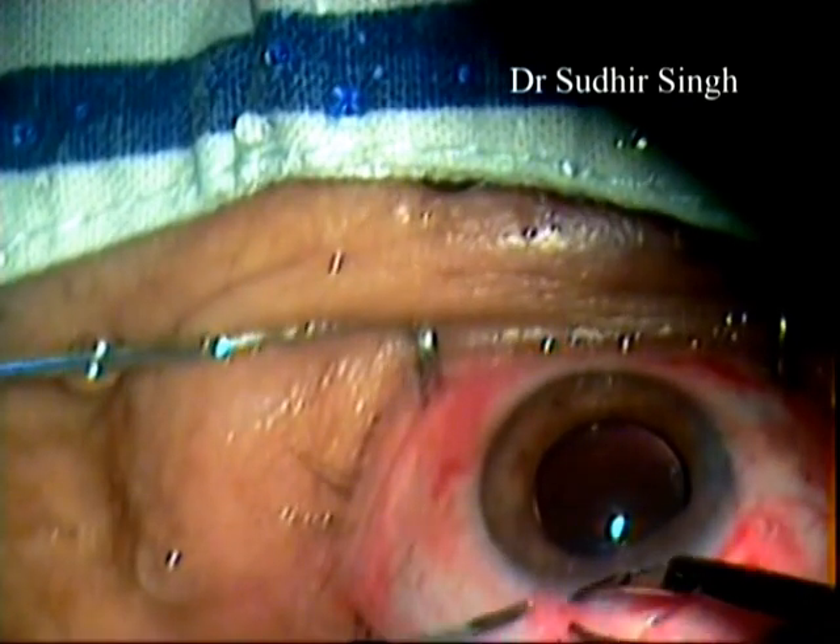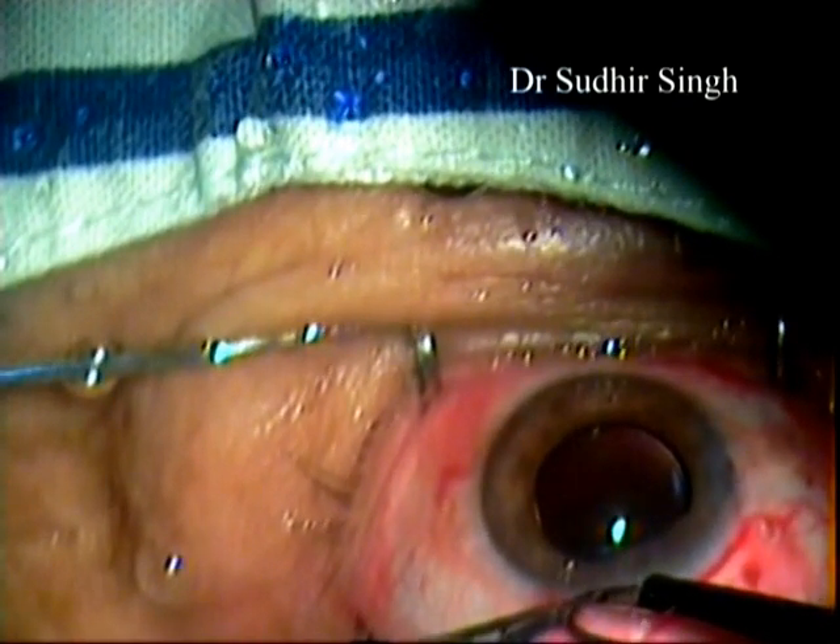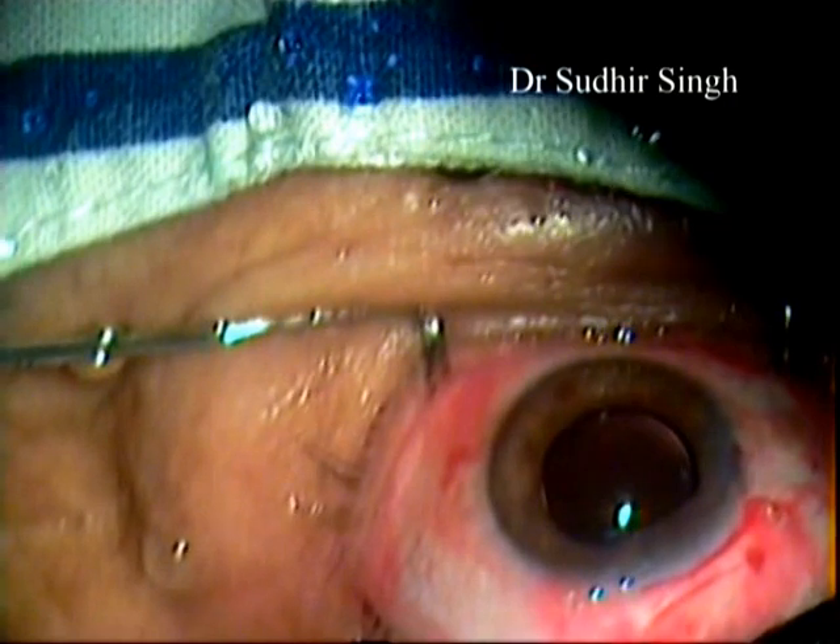The cut ends of the conjunctiva are sealed with cautery.